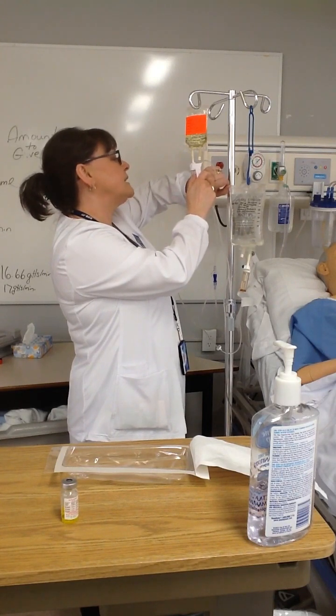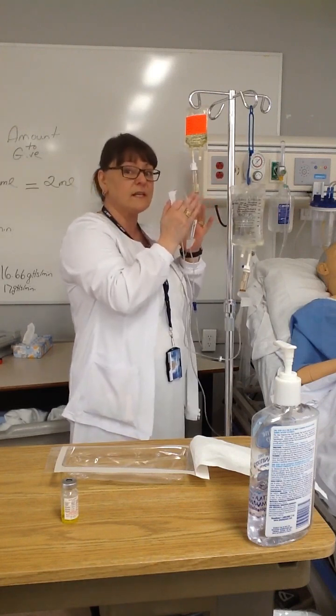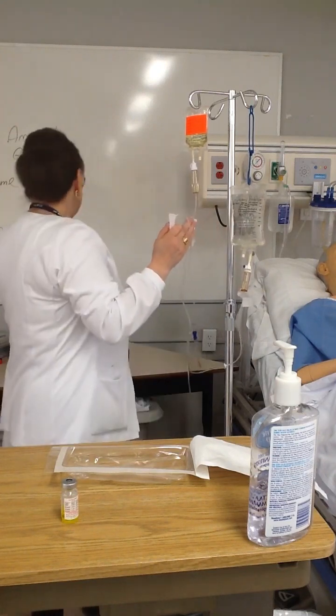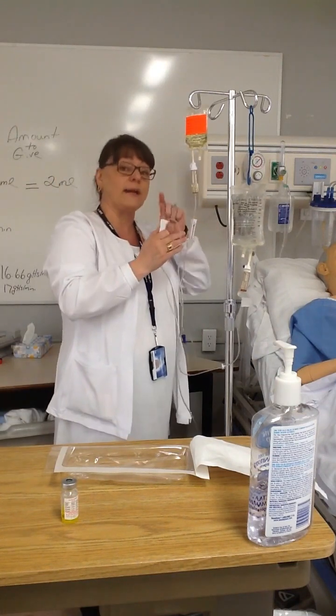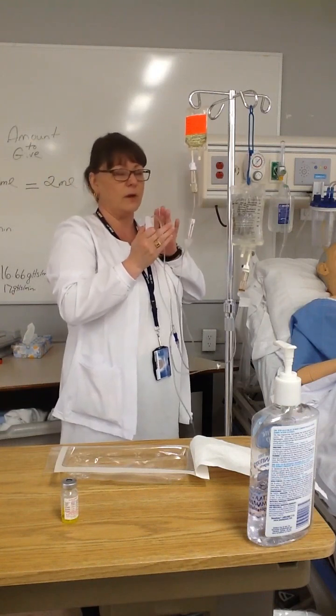Great, and I did. So now, after I do that little increment of 15 seconds, I'm going to count for another full minute and make sure that I have 17 drops in every minute, or I can be off 1 drop. It could be 16 or it could be 18, no more.